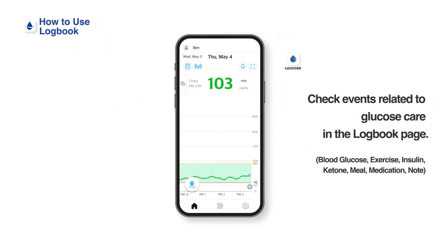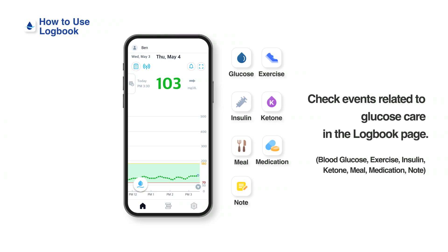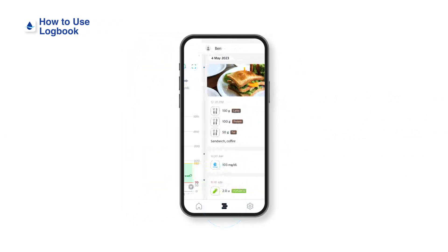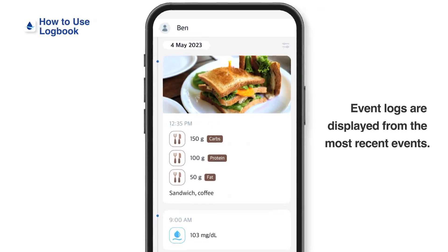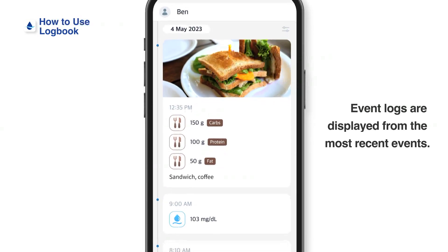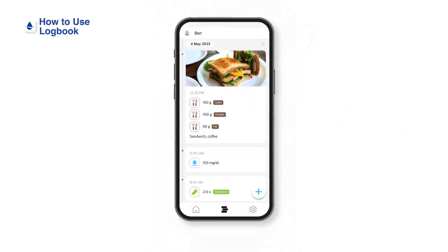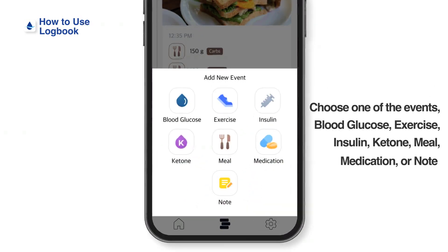You can add a variety of events related to glucose care in the logbook page. Tap Logbook at the bottom of the home screen. Recorded event logs are displayed from the most recent events. To record a new event, tap the plus icon at the bottom right corner of the screen.